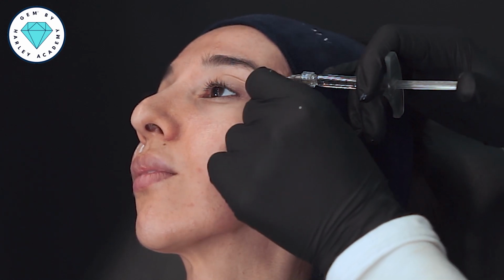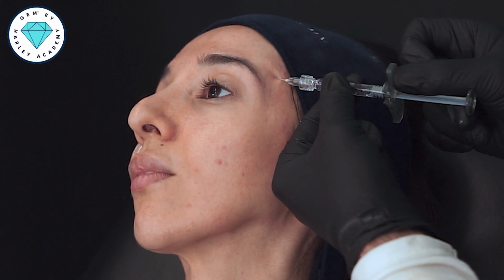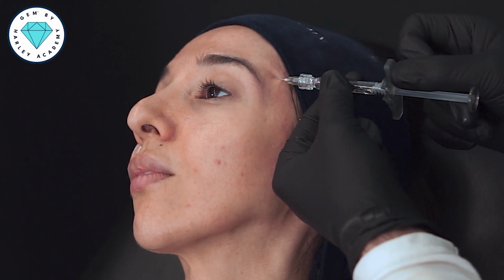So palpating for the superficial temporal artery, I can feel it here. It's not within my injection plane. It's more posterior. I find my target and I touch down onto bone. So that really didn't have to go very far because Hind has got very low subcutaneous fat. I'm confident this is down onto bone and I'm at a 45-degree angle and I'm going to have a really good 10-second aspiration.